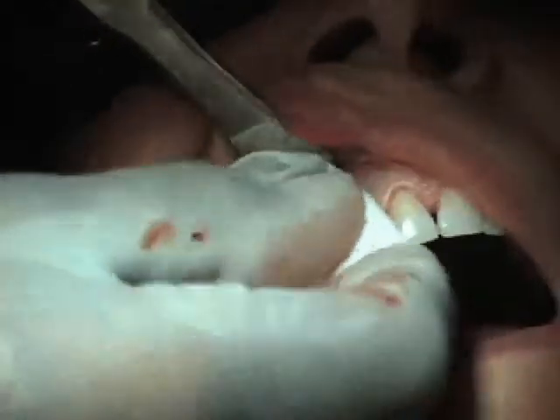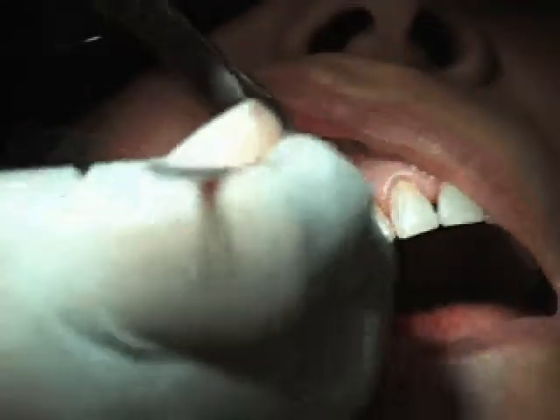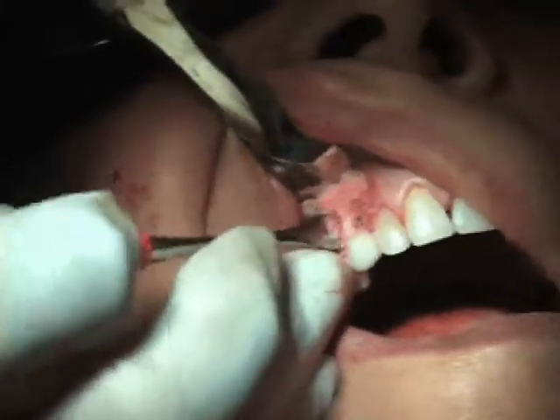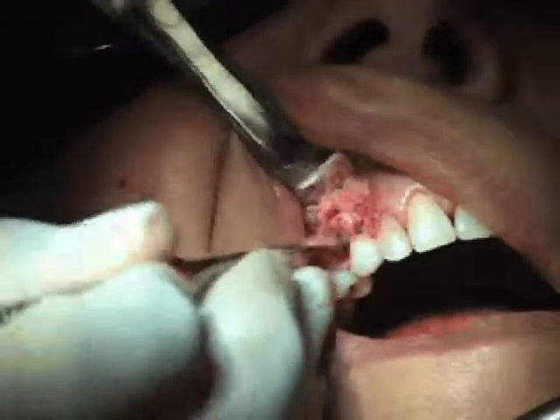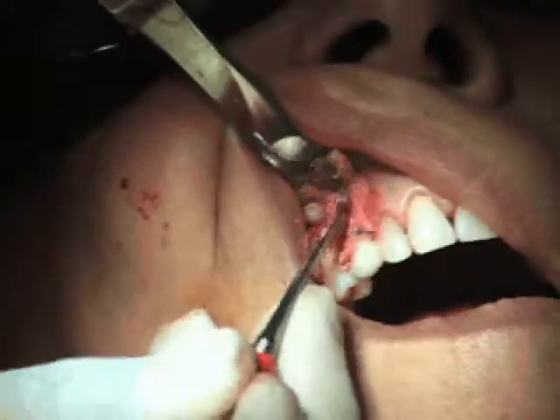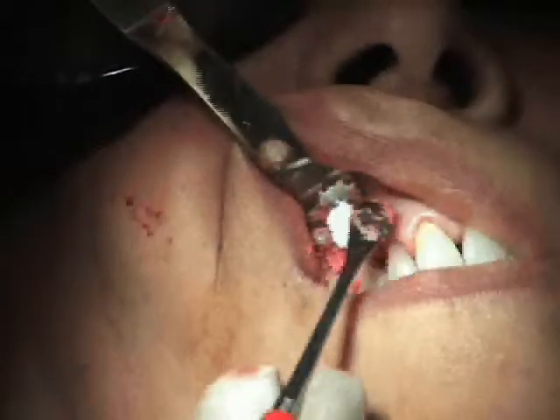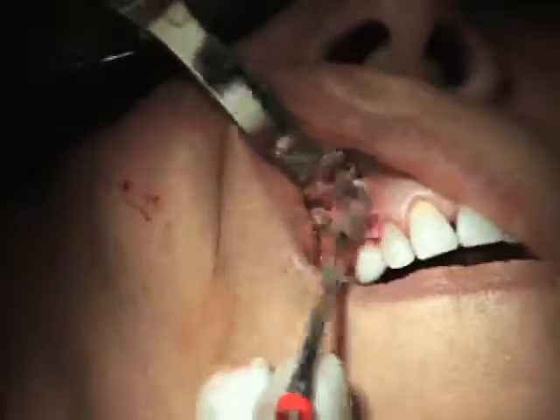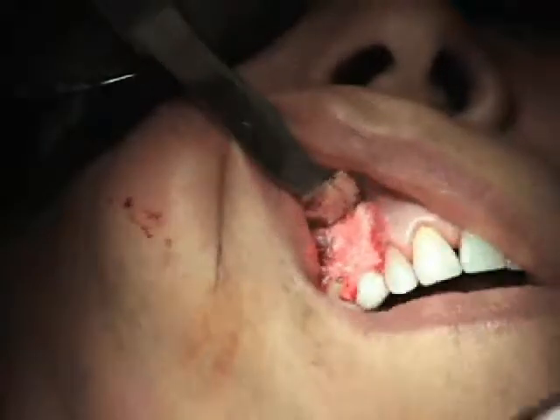I'm just going to keep packing this. I just have tissue on the other side, so I have to pack it around the other side, because I want to try and surround this with my graft. The reason I have the dense HA in here is it helps support the tissue, because the OsteoGen doesn't support it quite as well as the dense HA.